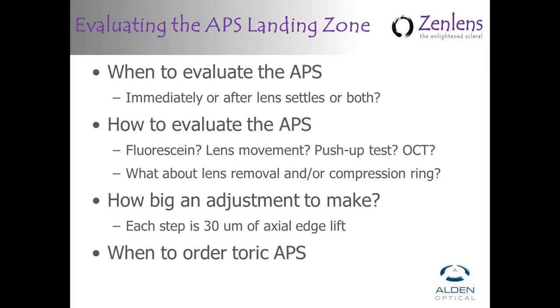We shouldn't see fluorescein rushing under the contact. That means the lens is just too flat and the edges are too flat, and it's going to create problems. I'd actually rather see little or no fluorescein exchange just with blinking. But then what I would like to do is use the patient's lower and upper lids to gently nudge some fluorescein under the edge of the contact. And to me, a proper edge is going to allow me to push fluorescein under the contact without a lot of effort.